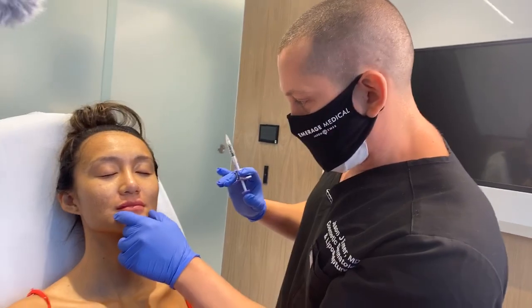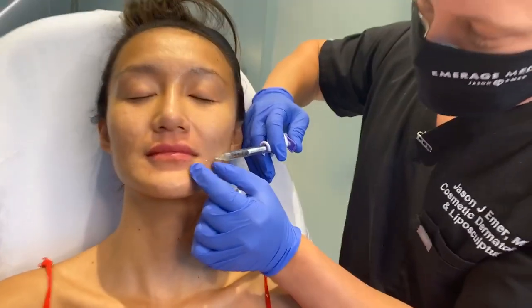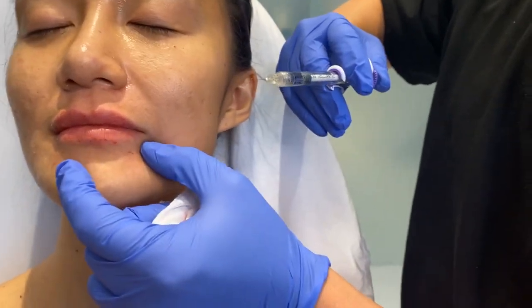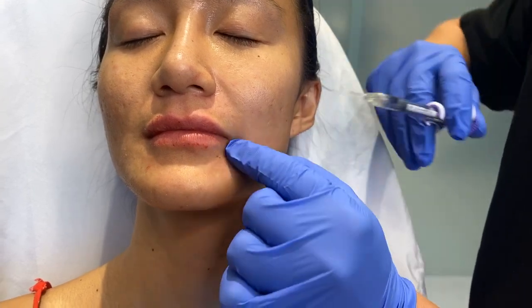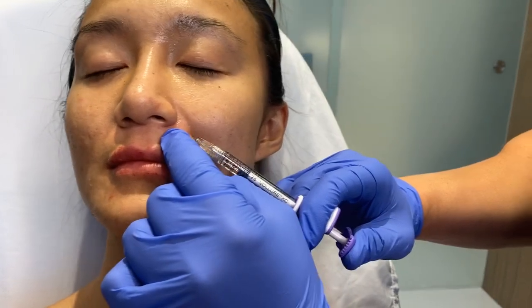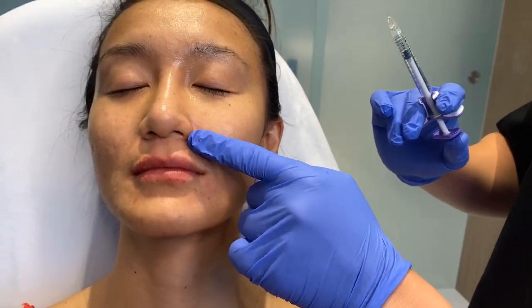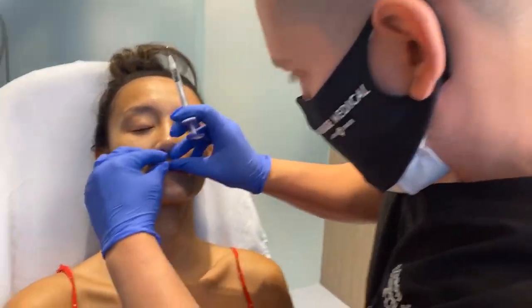Now, one of the things that is good to do as this sits for a little bit, right here on the lip corner, is to place just a small amount, because that helps support the lip itself and gives the corner of the lip a little upturn, not much. And then right at the edge of the fold, 1, 2, 3, sorry, it's a little sensitive. Also a little bit right here, because this area holds this lip up. Even threads in this area will hold the lip up.